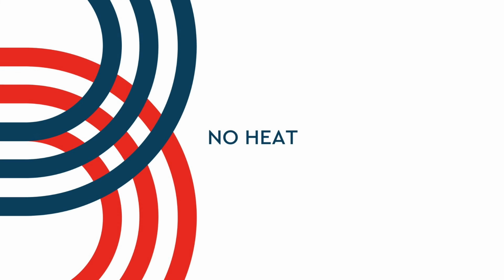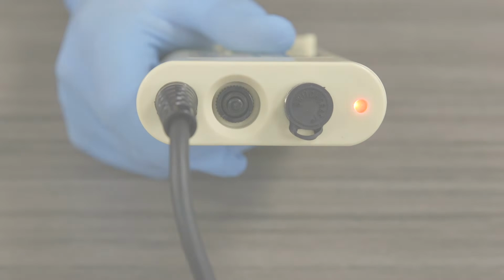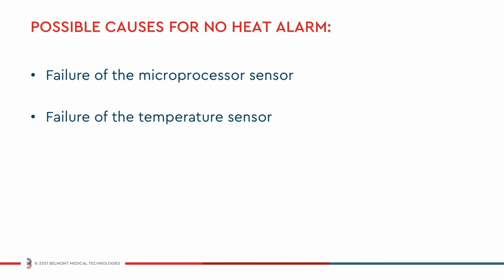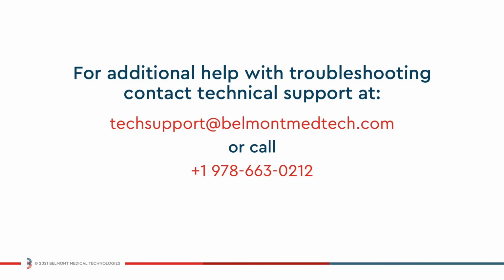If the system detects no heat to the heater plates, blue and red LEDs will flash and an audible alarm will trigger. A no-heat alarm may be caused by a failure of the microprocessor or temperature sensor. If the failure reoccurs, please contact customer service for assistance.